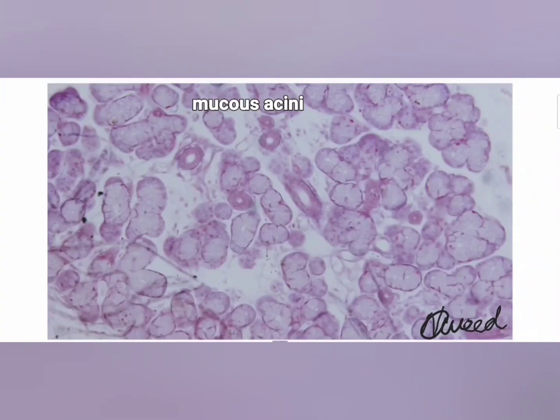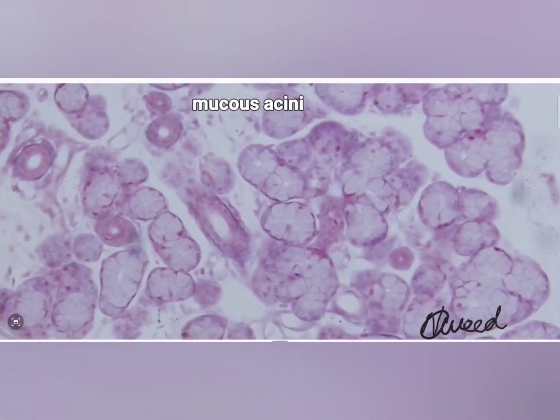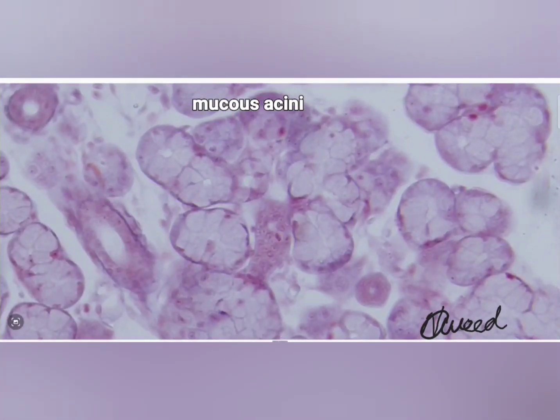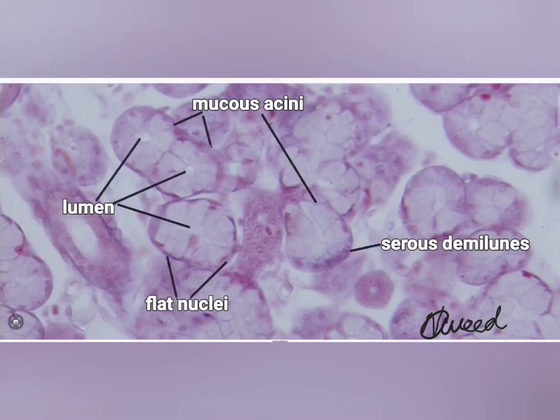The mucous acini are spherical or tubular structures, each consisting of epithelial cells arranged around a central cavity. The mucous cells are pyramidal in shape, but their nuclei are oval or flattened and pressed against the basement membrane.